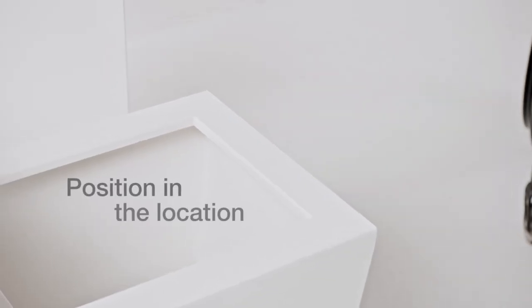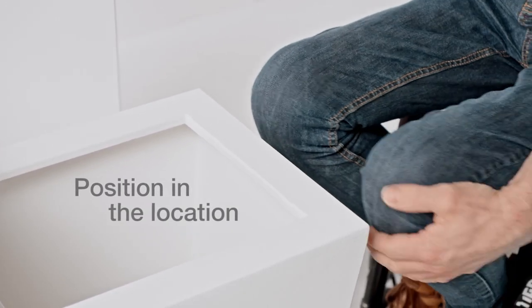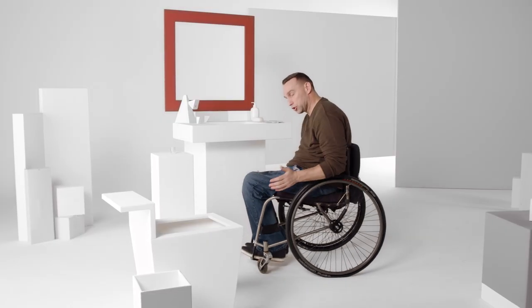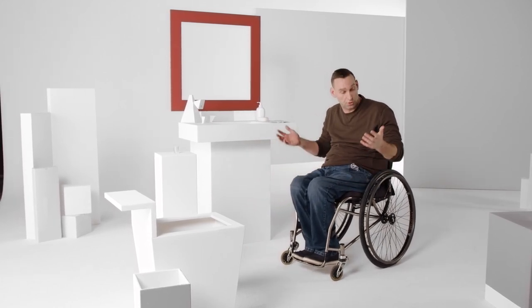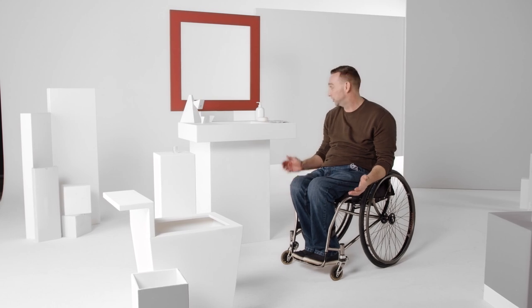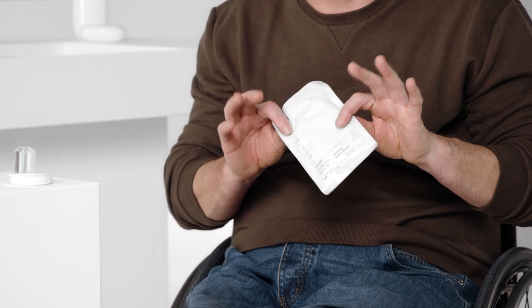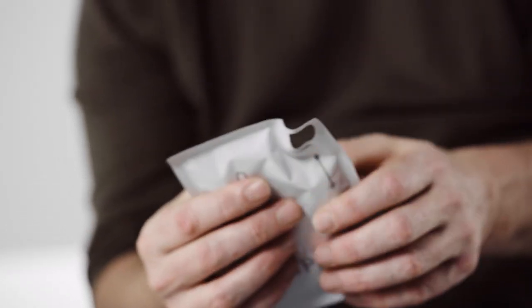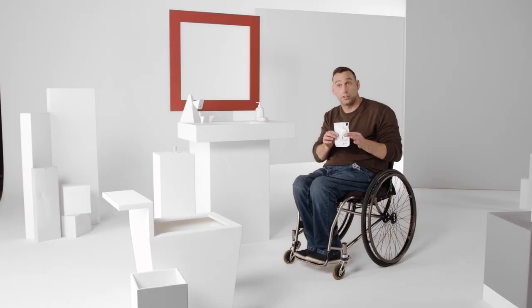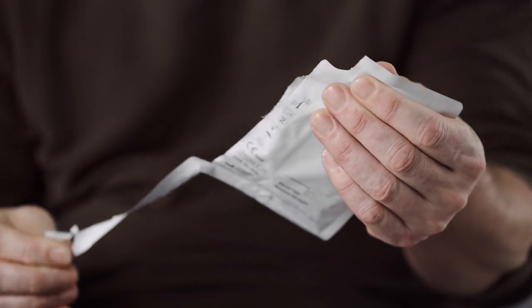Next, position yourself to carry out catheterization and manipulate clothing. I usually use my elbows to steer, making sure that I'm not doing any cross-contamination. Once I know that I've got everything prepared, I can unbutton my trousers and then go ahead and use the product swiftly and safely.